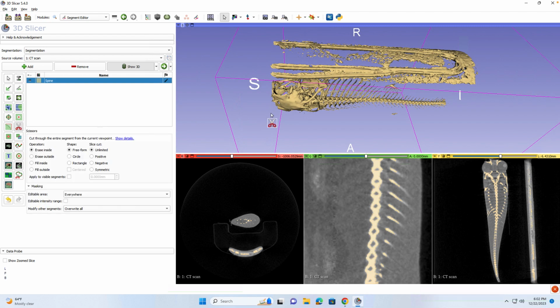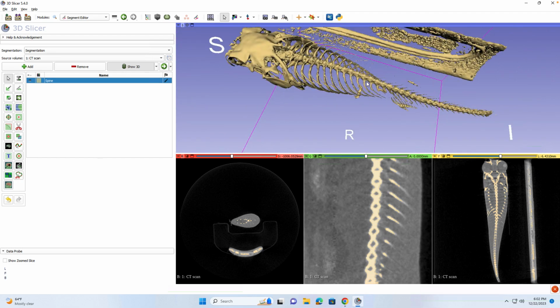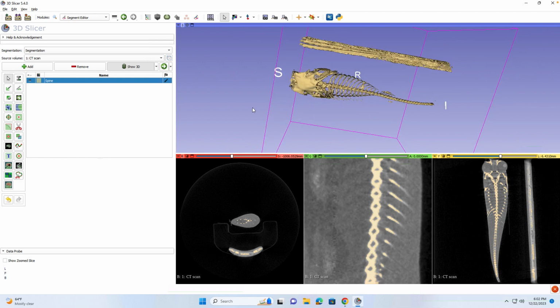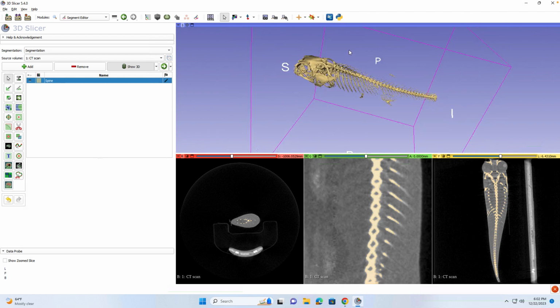So scissors tool, right? It's just essentially cutting out outside noise, or mainly larger objects that it's just easier to get with the scissors. So we'll just go on top of it. And the scissors will have a few options, but the most efficient one is just erase inside for what's necessary. You can usually leave it at that, and that'll bring us into something else.